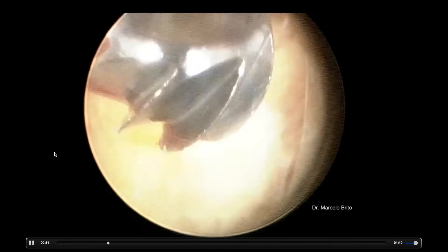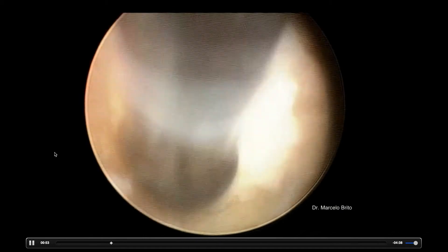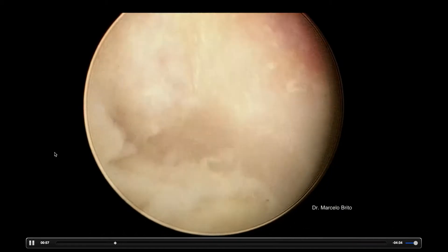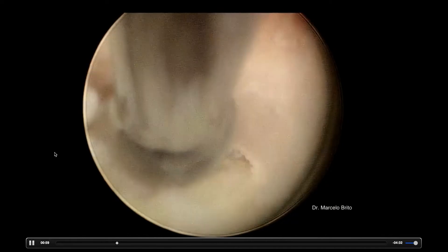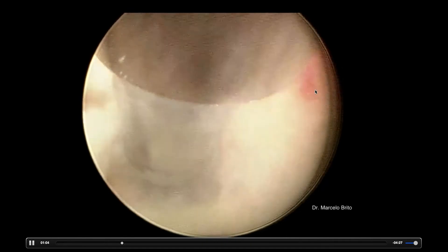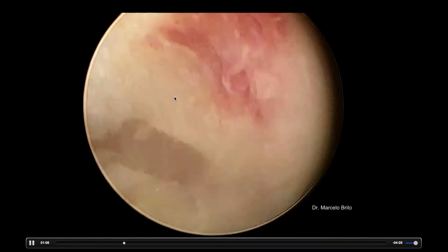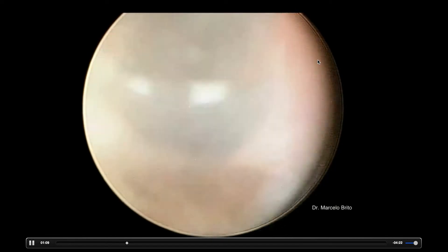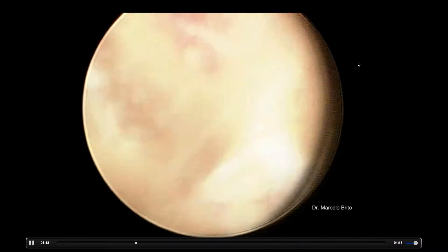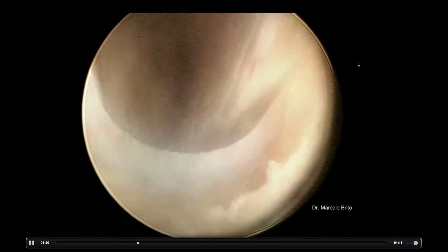We're going to use the burr and get our window wider. We clean the upper lamina, we clean the facet, we clean the lower lamina. And when you think it's sufficient, we start to take out the yellow ligament. This image shows the basis of the spinal process — we are on the top of the canal. If I get through this, I go over the top and go to the left side, the contralateral side.